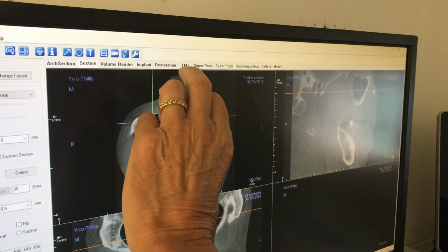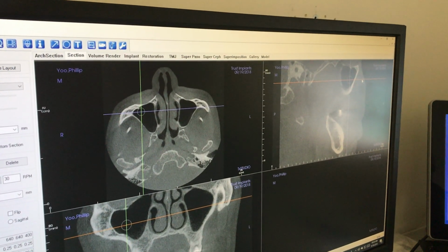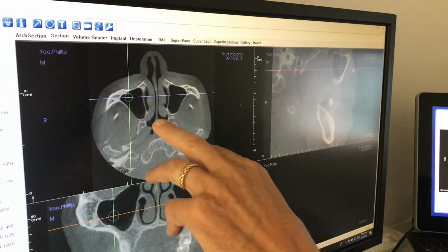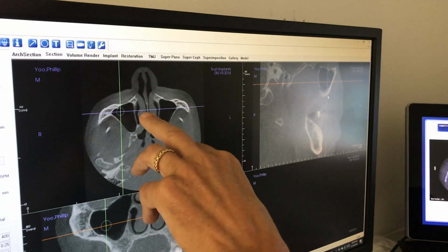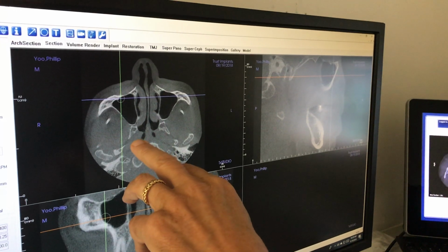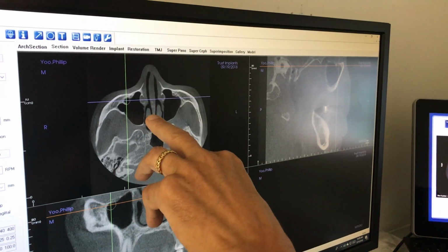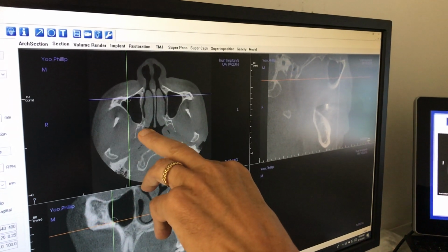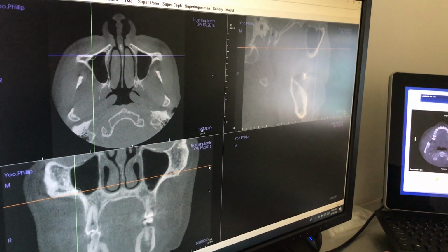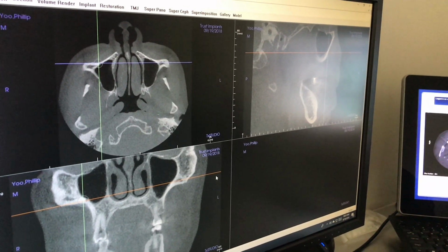And so this is the deviated septum from front to back, and it's almost universal in our finding. Okay, and as we go from top to bottom, looking at that septum, you can see it looks like you got two cement trucks parked in your nose. So you think you can breathe through that? You can when you're vertical.